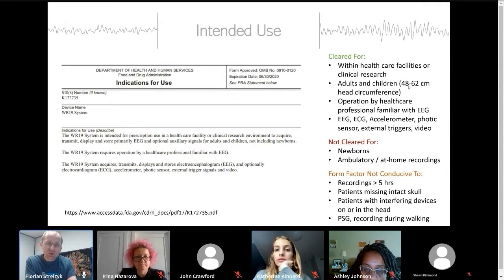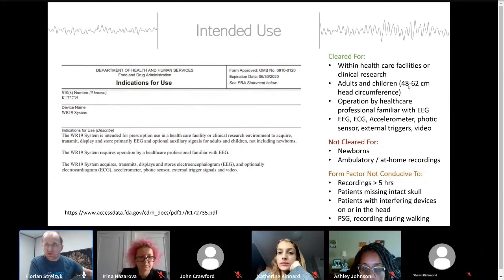And what do you do at 2 a.m. in the morning when you as an EEG tech might still be at home and a patient needs to be assessed because of altered mental status, because of needing to exclude non-convulsive seizures. Sometimes, and I'm not sure how that works with your facility, but we hear wait times anywhere from 4 to 8 to 12 hours before patients get their first EEG. Especially during off hours and weekend hours. That's a real concern for patients.